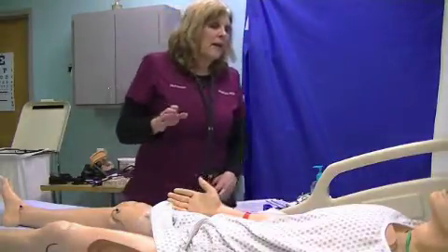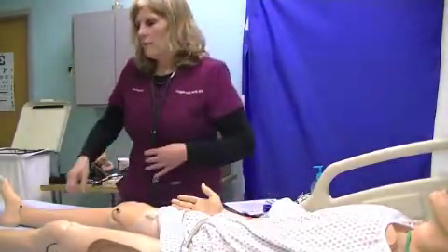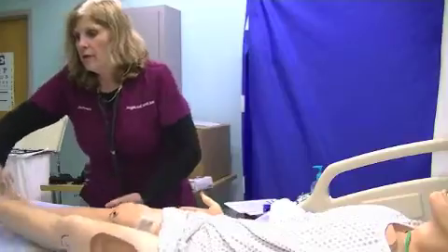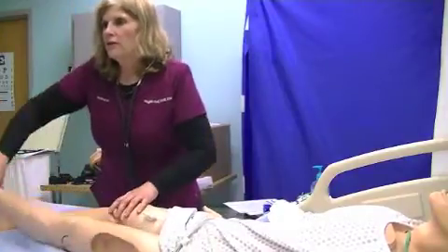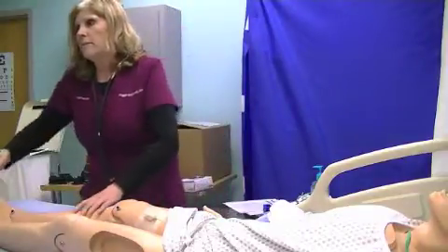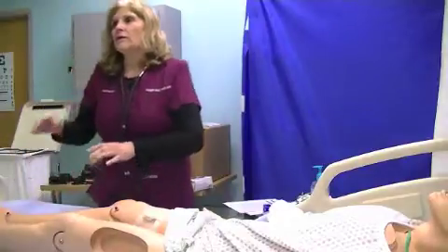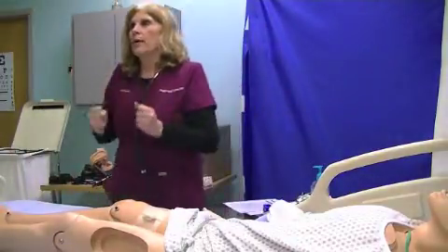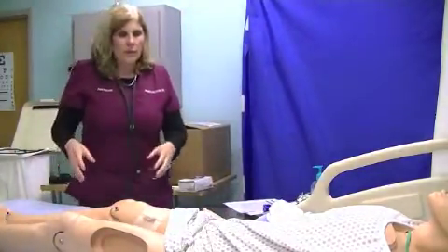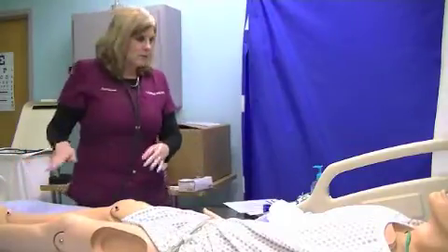You also need to make sure the patient has been lying down for the last 5 minutes, and you want to make sure that their legs are straightened out. If the person's legs are crossed, you can take blood pressure if they're sitting in the chair or laying down in bed, but the patient's legs cannot be crossed. If the patient's legs are crossed, the heart's going to have to work harder to pump, and so you're going to get elevated blood pressure. So you should always make sure that their legs are uncrossed when they're doing this.